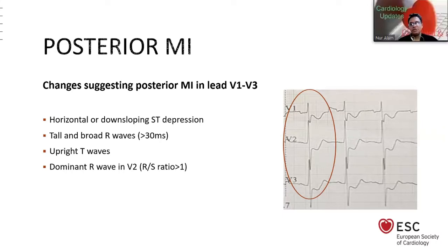Exactly, ST elevation in V1 or isoelectric ST in V1 and ST depression in V2 goes in favor of right ventricular infarction if associated with inferior MI. Inferior MI, sir. Yes, sir. Thank you, sir.